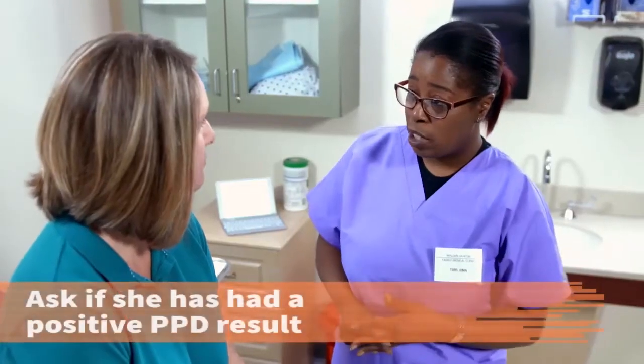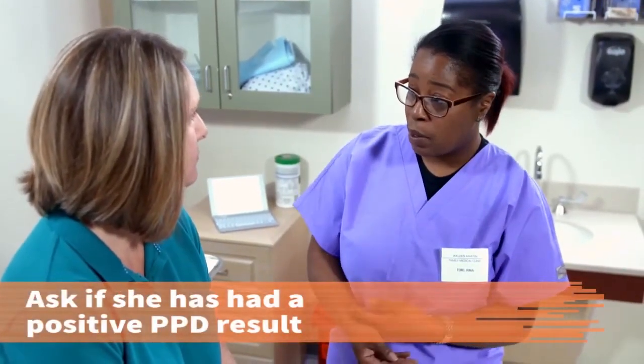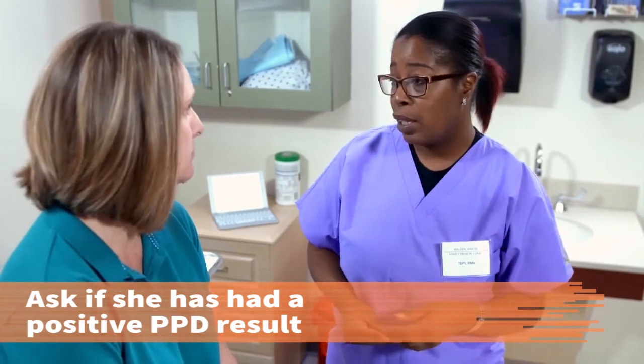Okay. Ask the patient whether she has ever had a positive reaction to a PPD injection or TB test. If yes, report this information to the provider before administering the medication. An individual with a history of a positive PPD test result always has a positive result because of antibody action.